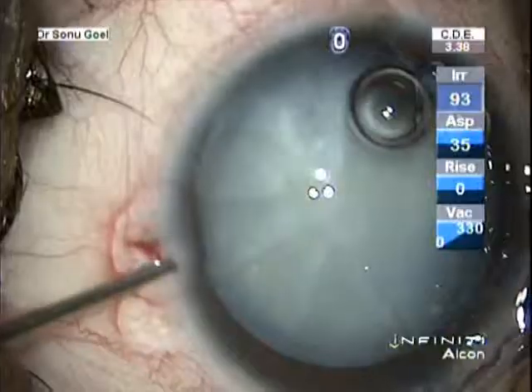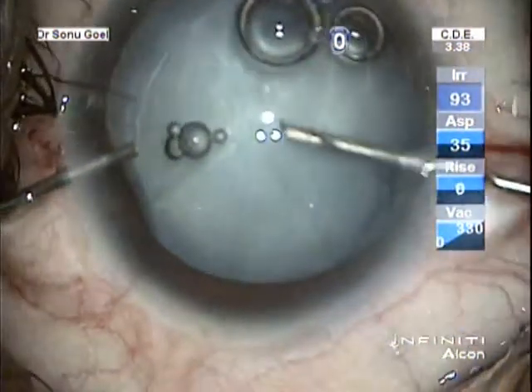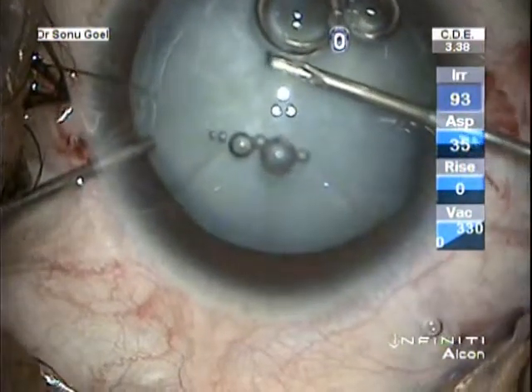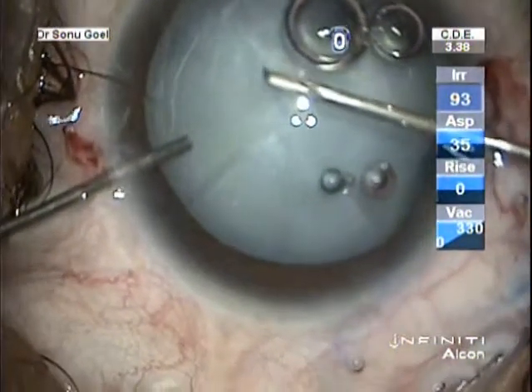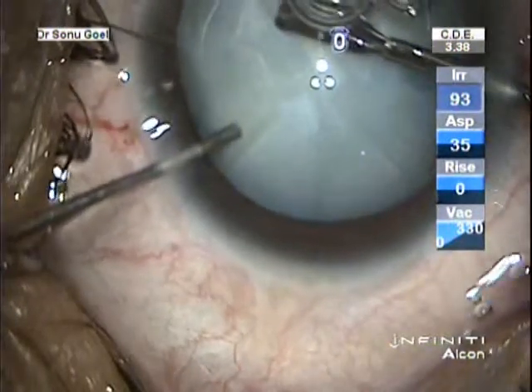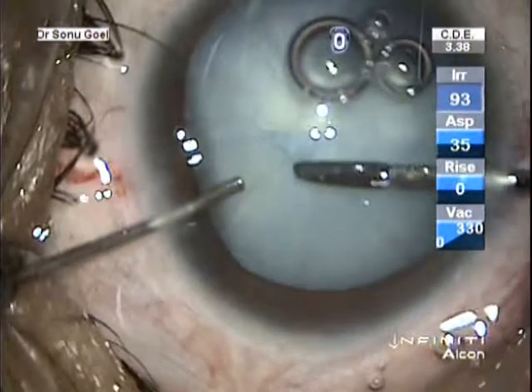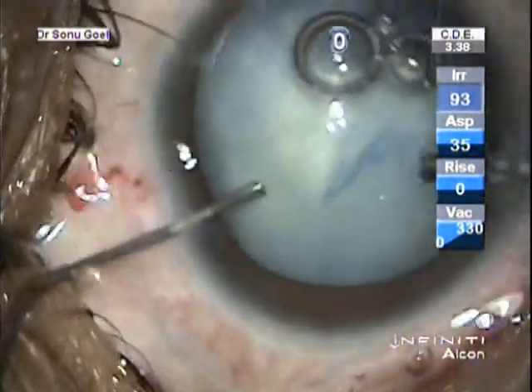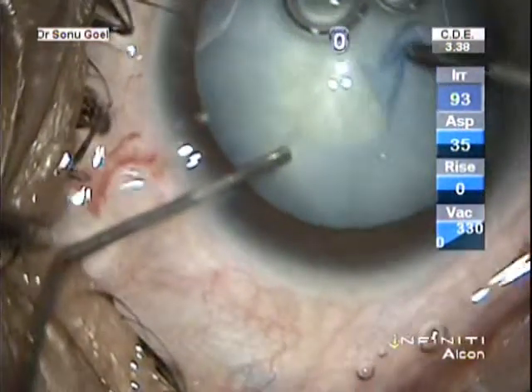Another white cataract, capsule has been stained with trypan blue, a nick is being made. So continuous viscoelastic is being injected, which can be noticed by the movement of the air bubble. The rhexis forceps is used to hold. And the capsule can be pulled easily, and this positive tamponade helps in completing the rhexis.